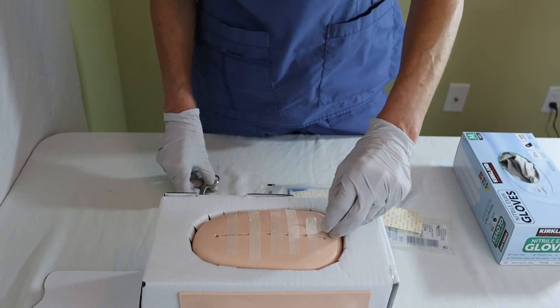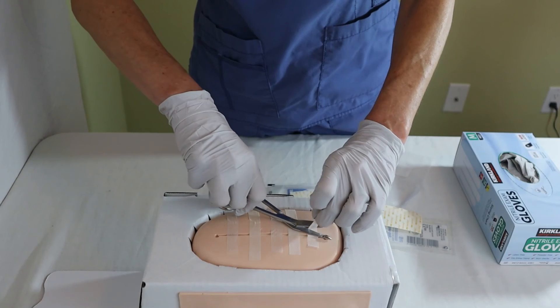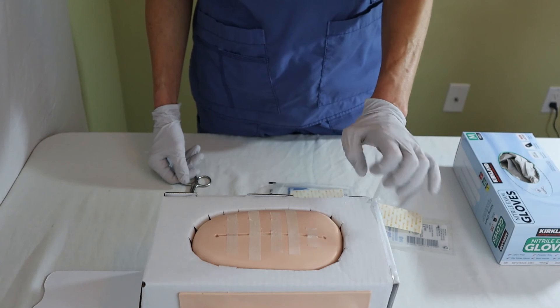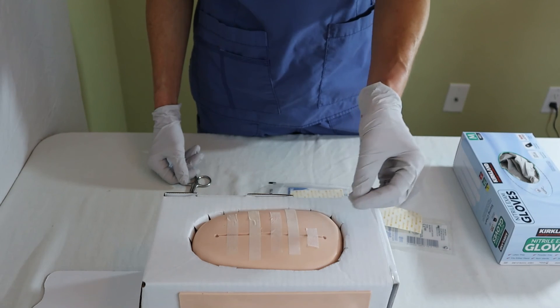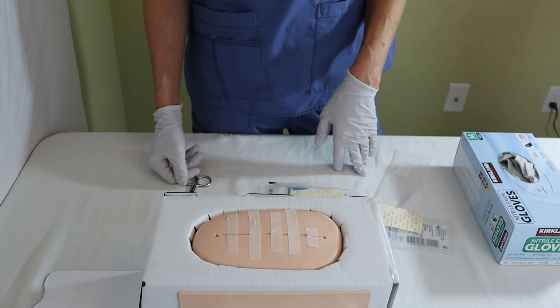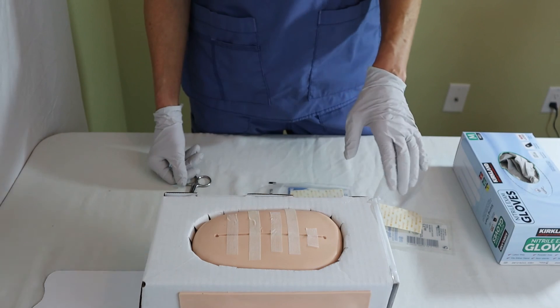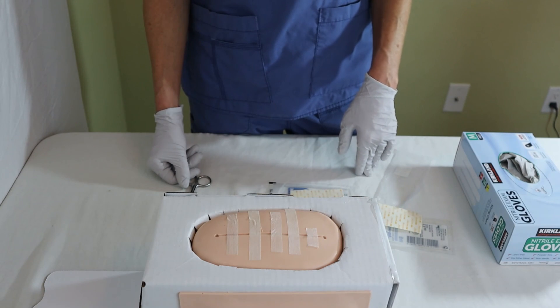If another strip starts to peel, which typically takes a few days, the patient can just trim the edges. It'll loosen up enough — most likely after water runs over the wound in the shower — and they can then very easily remove the SteriStrips. They'll typically stay on for a few days depending on activity level and water exposure. Clearly, because this wound is still fresh, we don't want the patient submerged in water — no bathtub or hot tub until completely healed — and they are instructed on that by their surgeon.